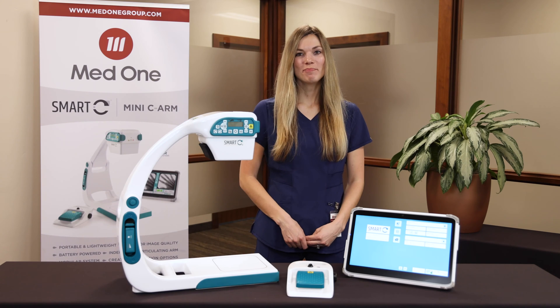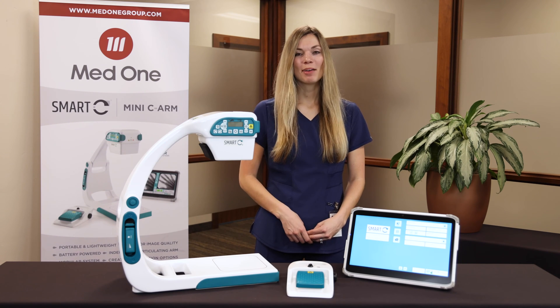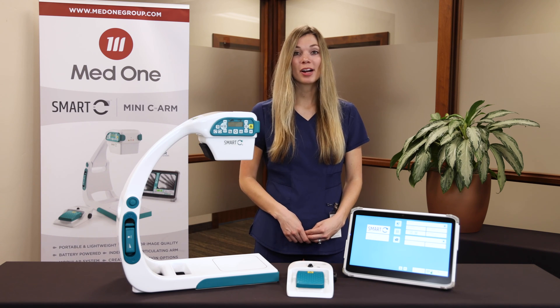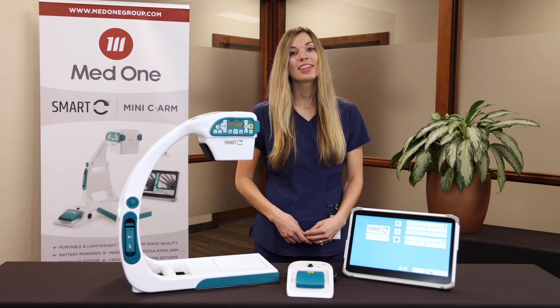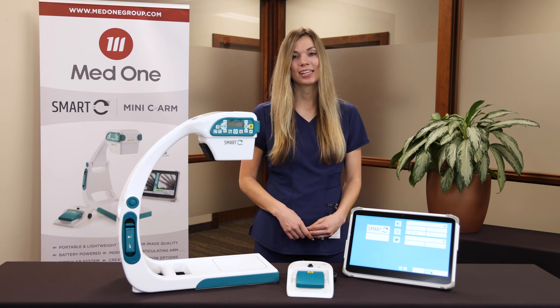Hi, my name is Anne Holland Bennett and I'm a Territory Sales Manager at MedOne Group. I'm here today to provide a demonstration of Turner Imaging Systems Smart-C. The Smart-C is a mini-C arm designed to provide physicians with real-time general fluoroscopic visualization of adults and pediatric patients. The Smart-C is intended to aid during diagnostic procedures, therapeutic treatment, or surgical procedures of the limbs, extremities, and shoulders.